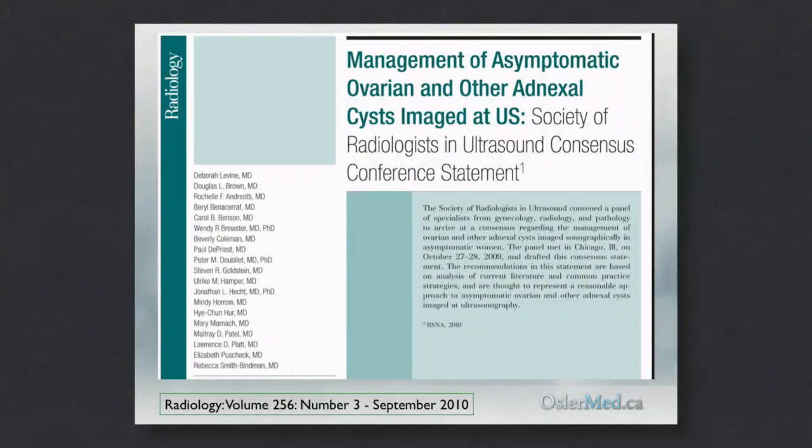And I would like to refer you all to this excellent article, Recommendations from the Society of Radiologists in Ultrasound, published in Radiology in September 2010, which has recommendations for management of simple cysts and indeed some complex cysts, but we'll focus here on simple cysts in asymptomatic women. And a summary of some of the recommendations I will highlight here.